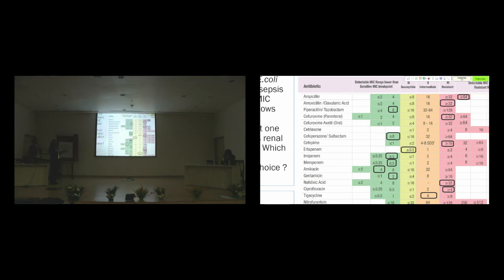So how do we use it? This is the template. What you see is the template, the complete template. This template is available for each of the panels. For 280, a template is available. For 281, for staph and entero, a template is available. For strepto. So in this template, what we are supposed to do is, these black highlighted ones are the MICs of a clinical isolate. When we get a Vitek report, there are MICs of a clinical isolate.